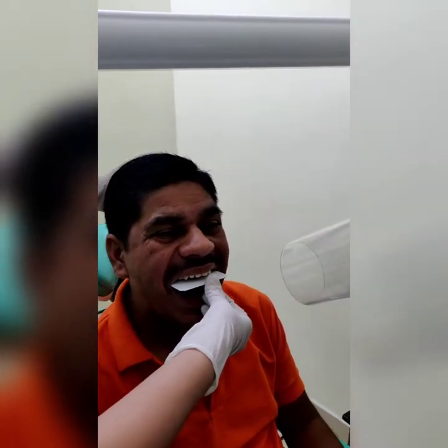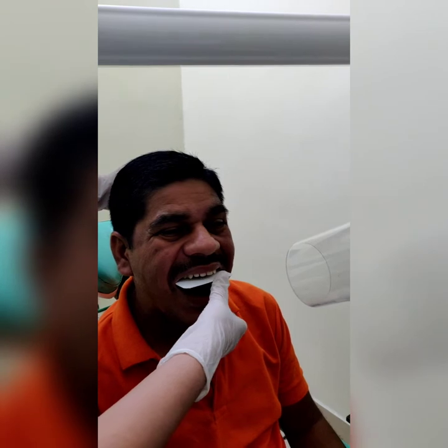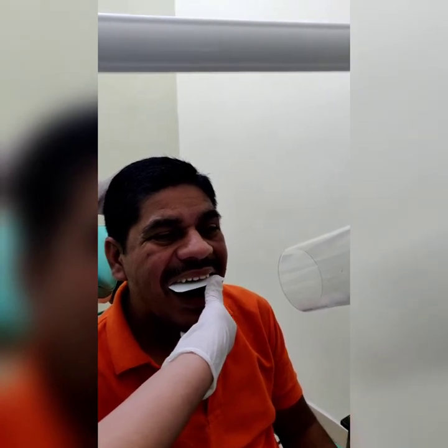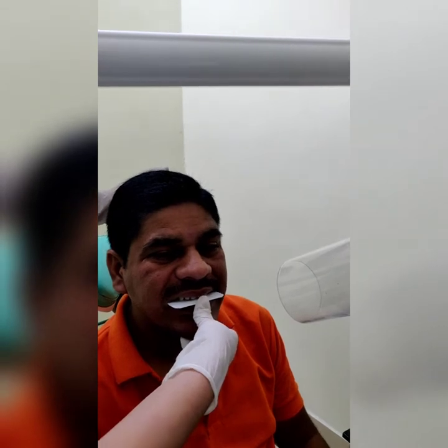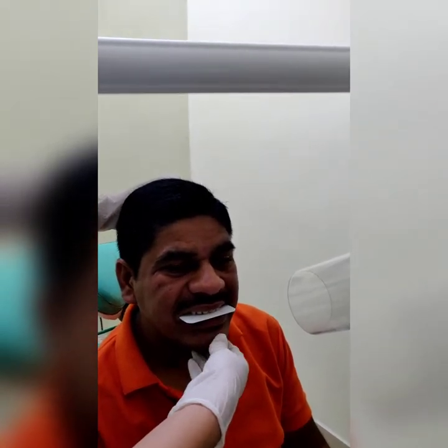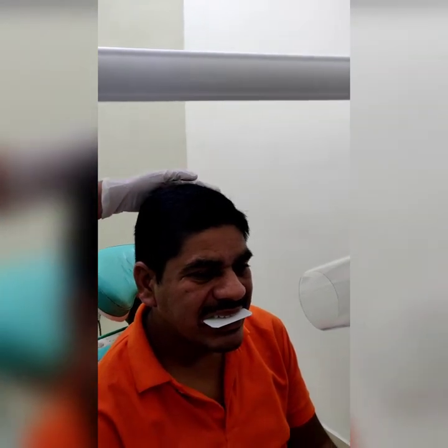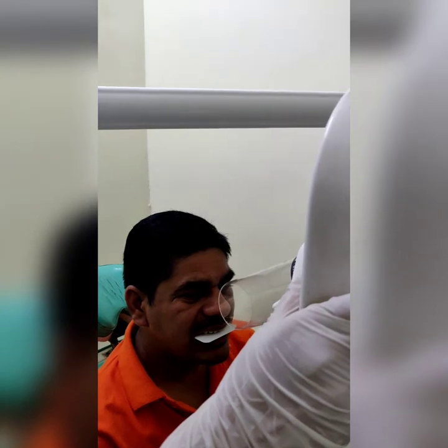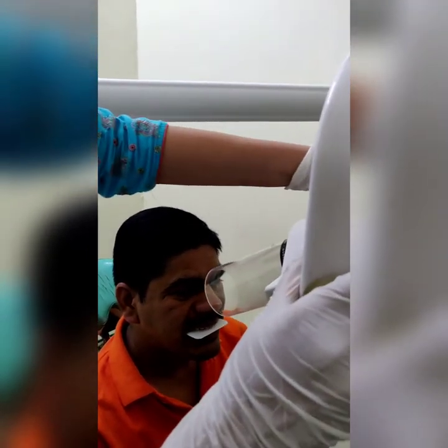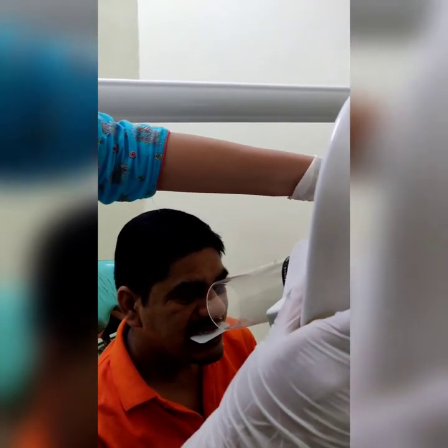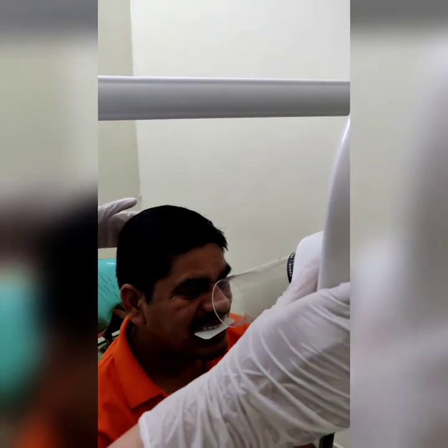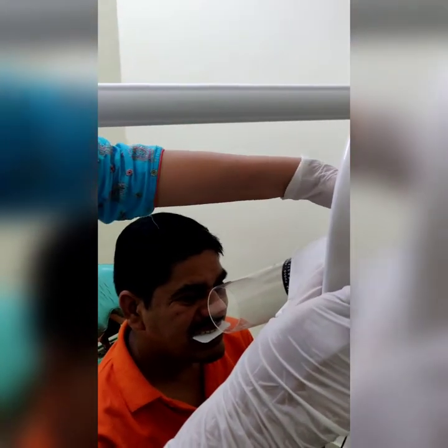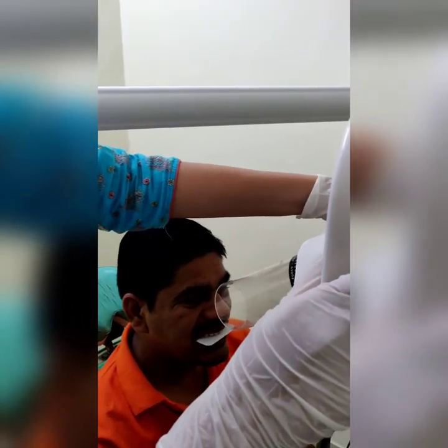The patient is asked to slightly bite to stabilize the film. The vertical angulation is plus 40 degrees and the horizontal angulation is 0 degrees. The central ray is directed from the tip of the nose.